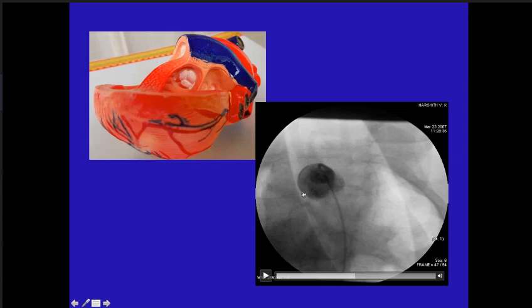And you know it's the left coronary artery because of the way it divides. It bifurcates into circumflex and LAD, whereas this doesn't bifurcate. In fact, if you carefully see, you can see it running in the AV groove here. You got it? Now you understood what is the CTGA coronary pattern?